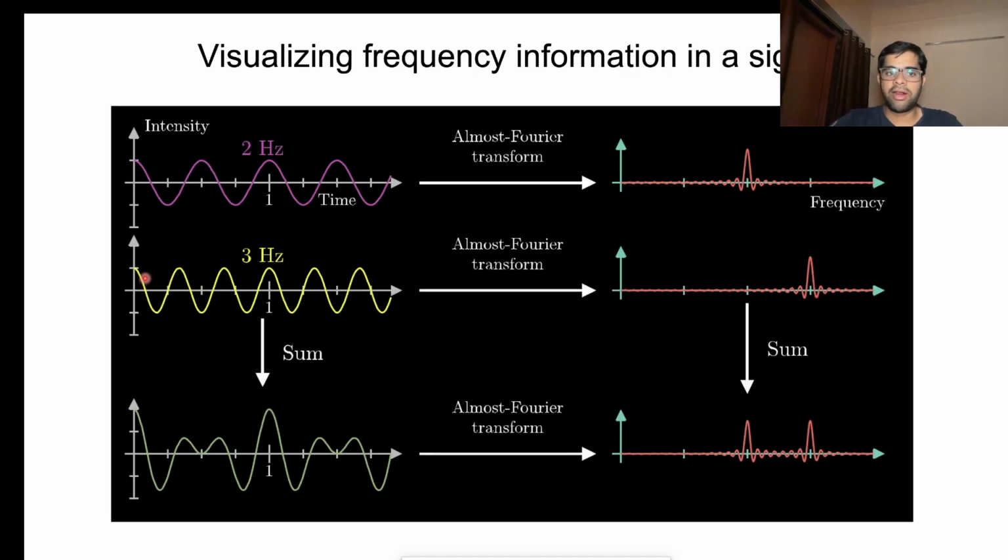Also, just for making it simple, here we are only using one amplitude of one oscillation. But if the same oscillation is of higher amplitude at some times and low at other times, you can also plot a 2D Fourier transform kind of thing. We'll see that in future classes, but there you can see at which time this particular oscillation is more prominent and at which time it is not very prominent. That way you can also infer what state of brain it is.